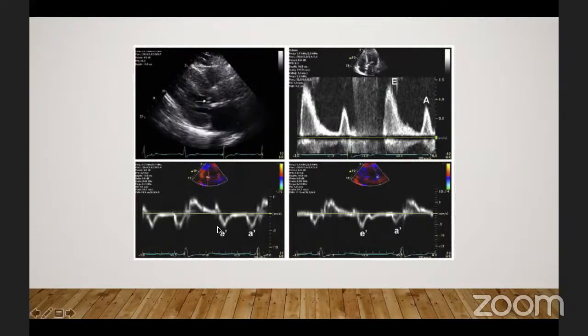And this is the same concept, but because it's assessing the myocardium itself, and the movement during diastole is going a little bit away from the probe, that's why the Doppler image will be reflected down rather than up.